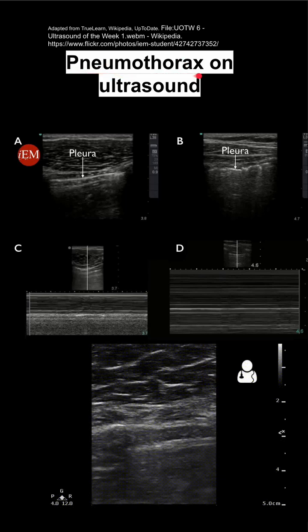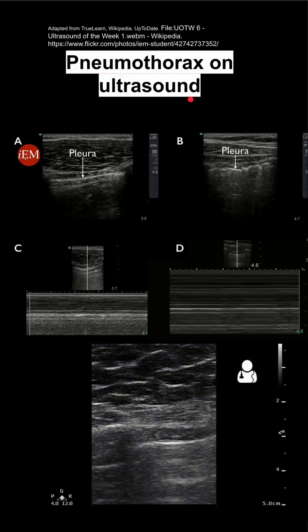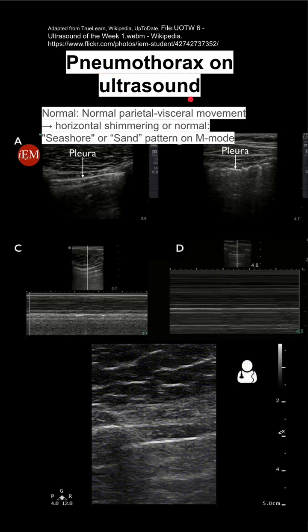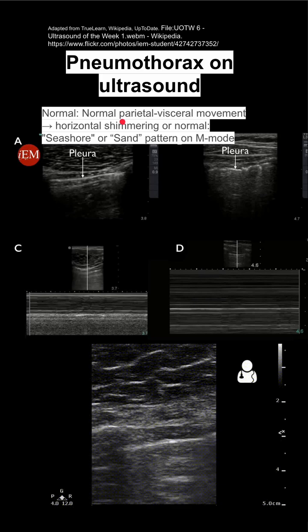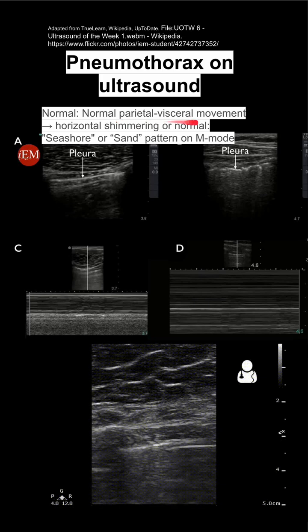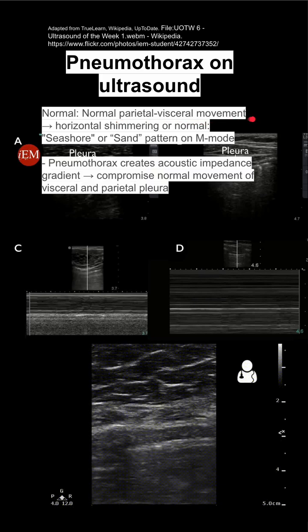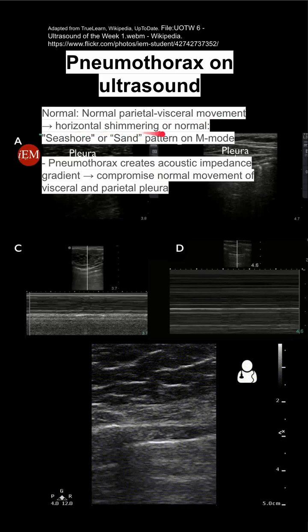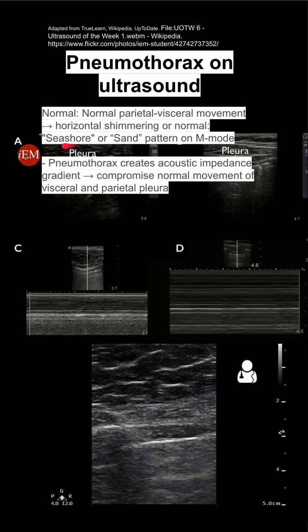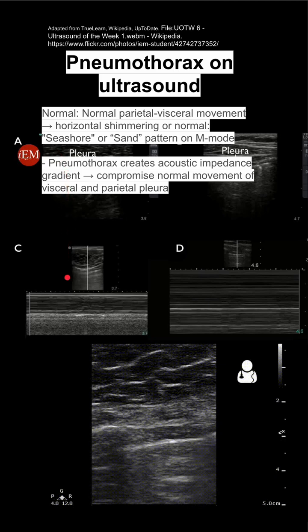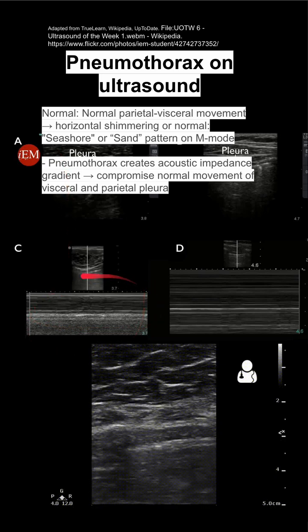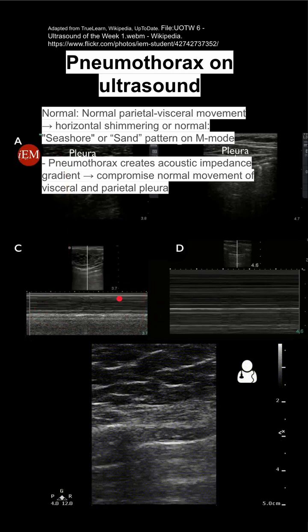This is how a pneumothorax appears on an ultrasound. In a normal lung, you'll have a normal parietal-visceral movement gradient. You'll have normal shimmering, and in M-mode you'll have a seashore or sand pattern as shown here.